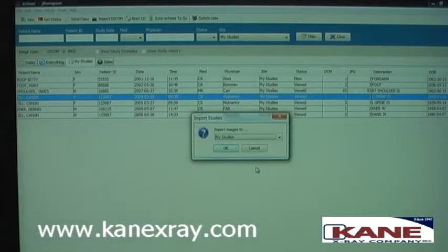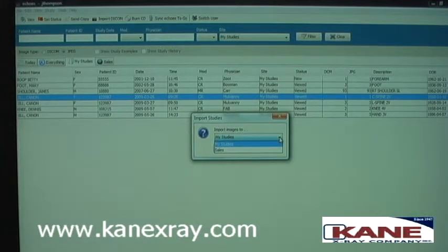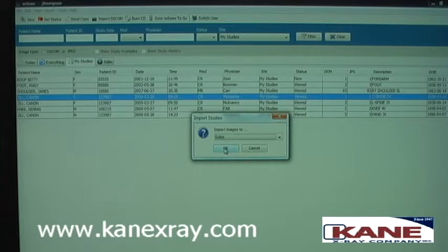It will also ask you where you'd like to import those studies to, which can either be My Studies, which is the local workstation, or to your server, and hit OK. It will import those studies directly to your server.